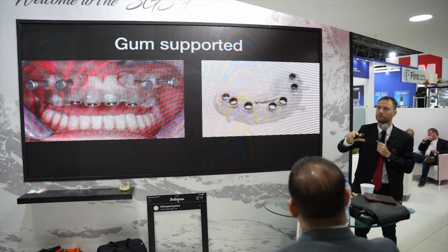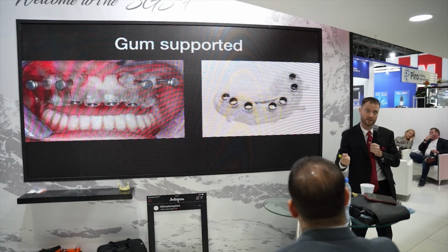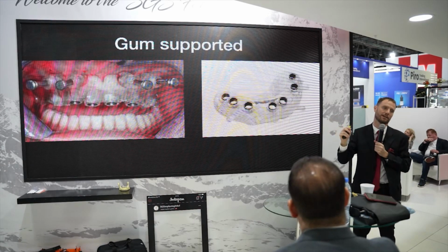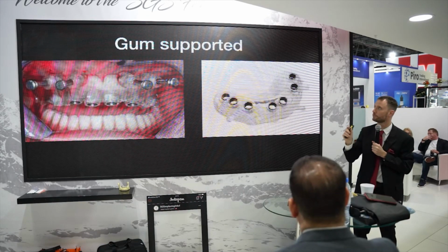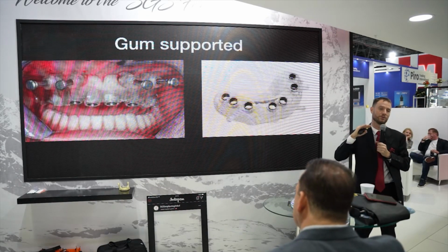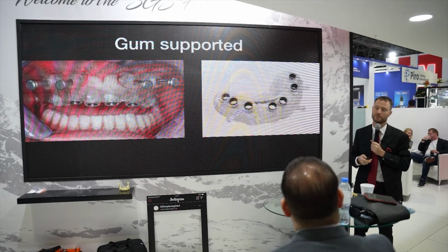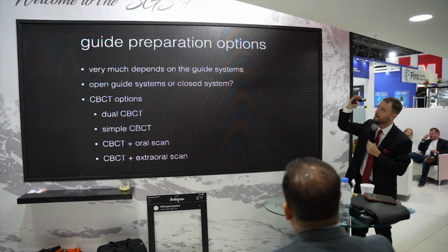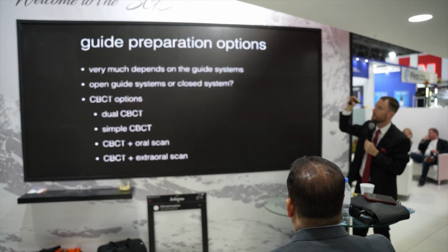It will be influenced by how much you push, whether you push stronger or your nurse pushes stronger on the other side, or when you do the skeletal anchorage, when you do the pins, is it really in the right position or not? So it will really influence it. So I really warn everybody, when you use the full guide, be aware, here we have much more torsion than what you expect.